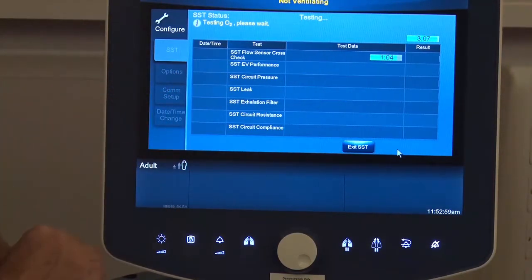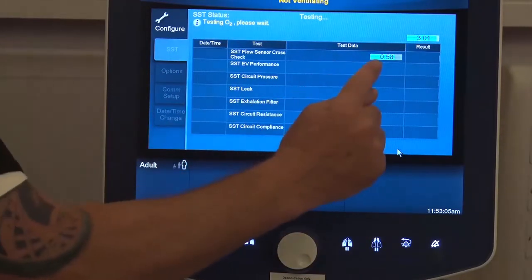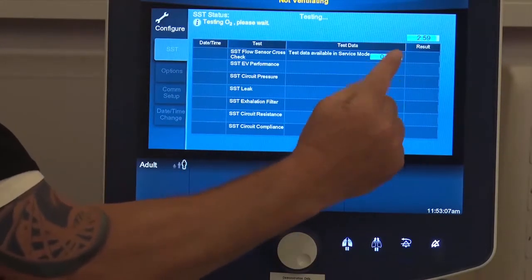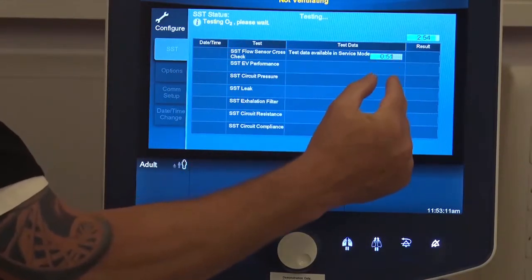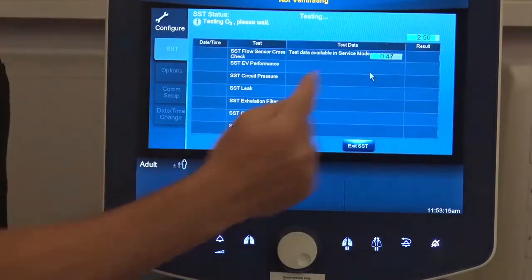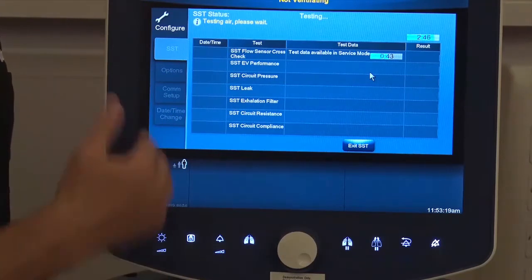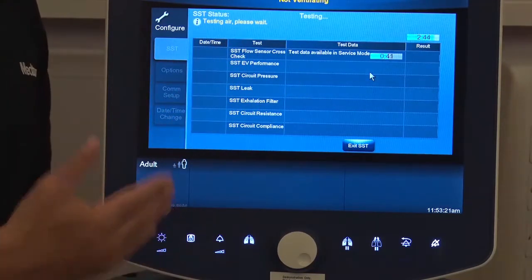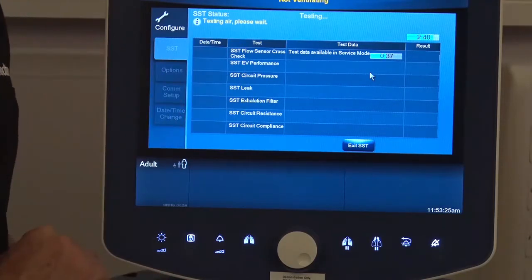There's really not much to do right now. Just leave the circuit, try to keep it motionless. That's why I say hang it. And you see you have a timer that's telling you how long for this particular step, and that little timer will follow as you go through all the steps. And then there's a total timer. And like I said, this is a much faster workflow than the training video is making it appear, because I'm talking so much. This really is about 3 or 4 minutes.